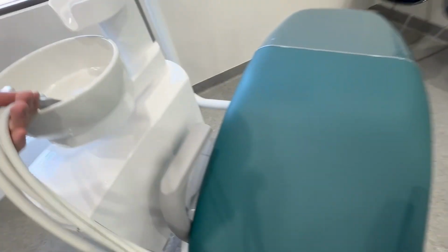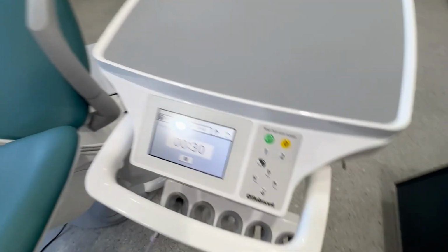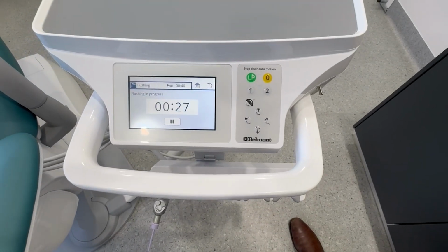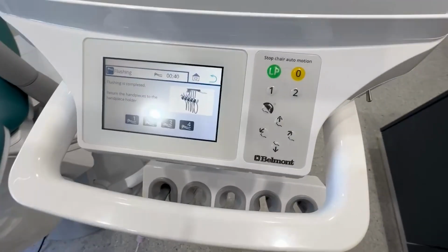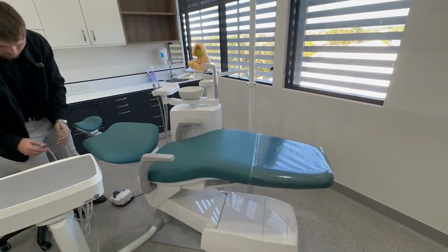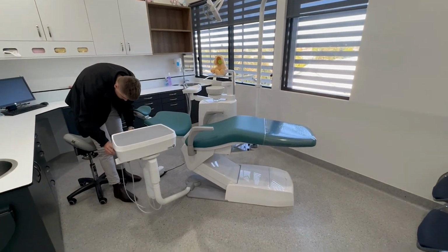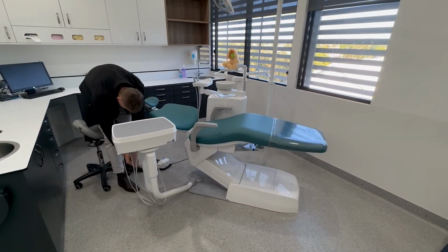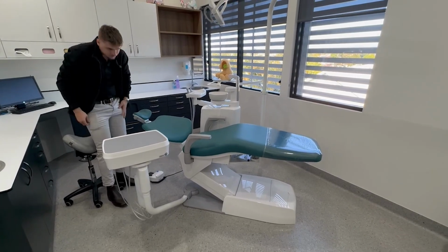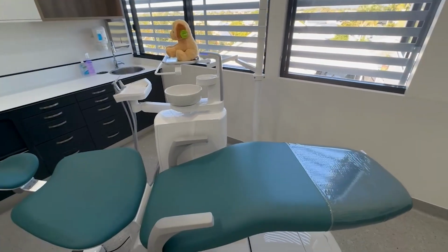If you do the long flush, it'll obviously do a longer flush, and it will also bring in the spittoon and cup rinse features. We can pause or stop that by hitting the foot pedal again, and then we can put those back into the hanger. I would recommend doing the long flush every day, so you're getting a good flush out of the system. That would also mix in with your biofilm treatment procedures, which we won't go through now, but they're very important. We've got those on other videos. So just bear that in mind as well.